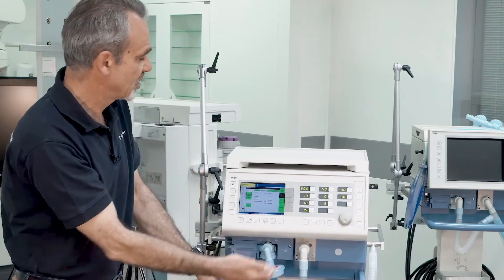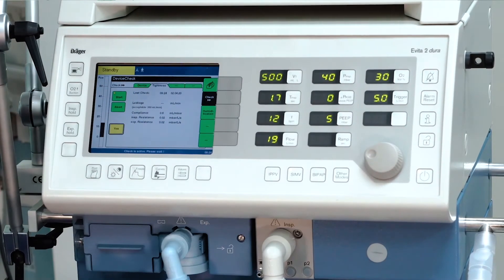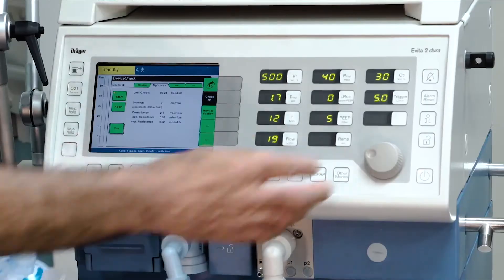Seal the Y piece by putting it on the connector and confirm with yes. Remove the Y piece and confirm.